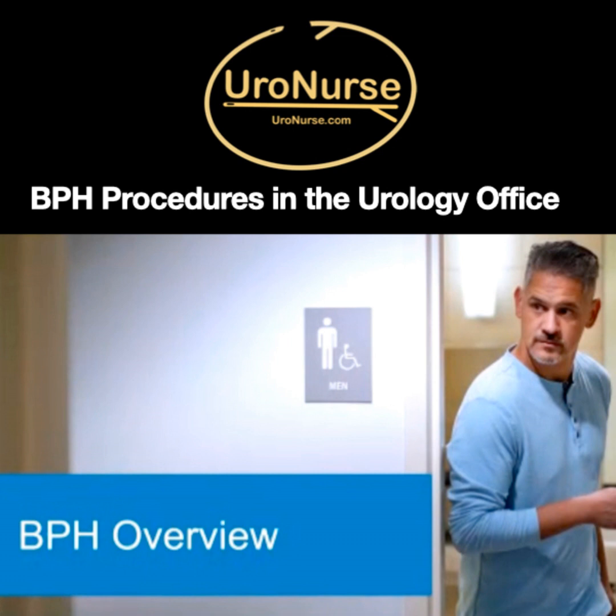Now let's talk about Rezum and the in-office BPH procedures. And I'll go through this again in a little more detail shortly, but the way I do all of my office procedures, 99% of them, is a combination of a local block and nitrous. And I'll get back to that in a moment. But what is Rezum? Basically, I tell the patients it's like a cysto, and then through the scope, we're going to inject some steam therapy into the prostate.